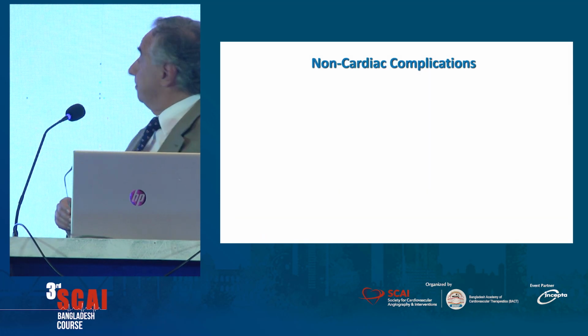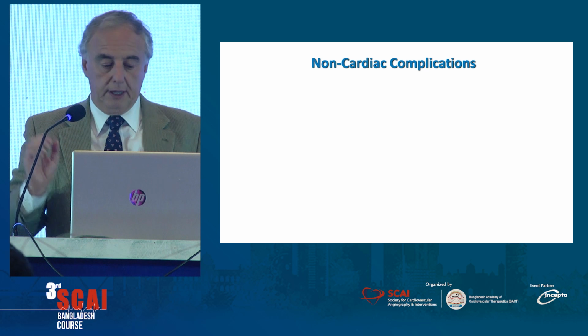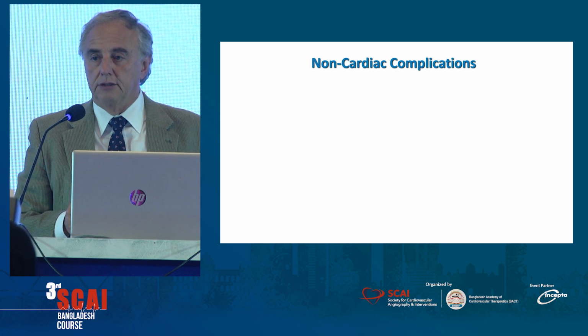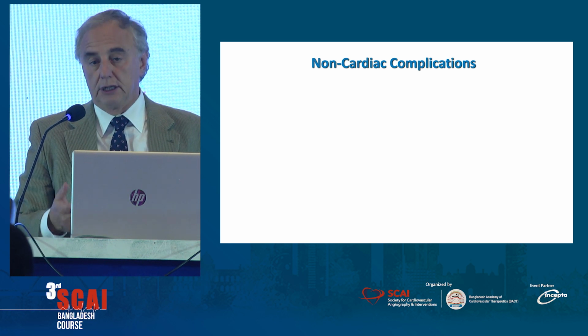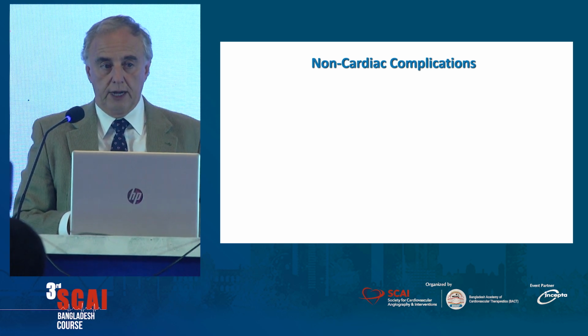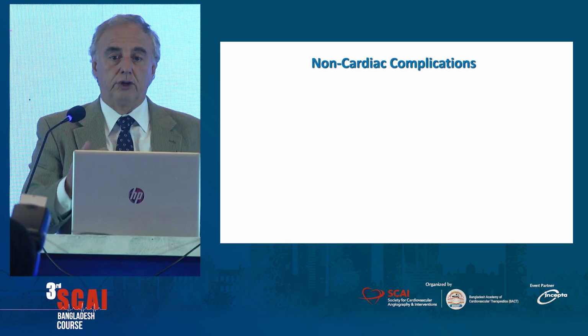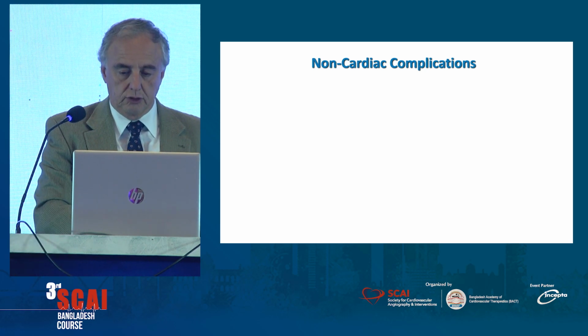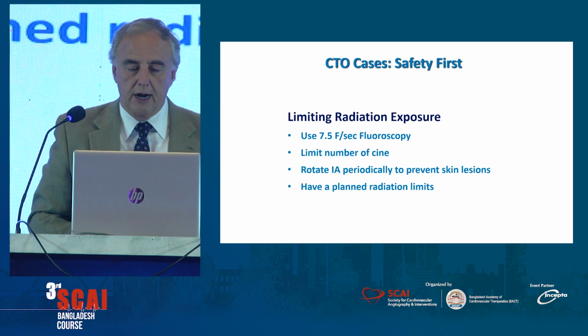All right. So CTO complications. Certainly, CTOs, as we all know, are more complex procedures, and there are more complications, so you have to be aware, as well as the patient has to be aware, because most of these patients are coming for angina, so you do not want to treat angina and leave a patient with a major complication.